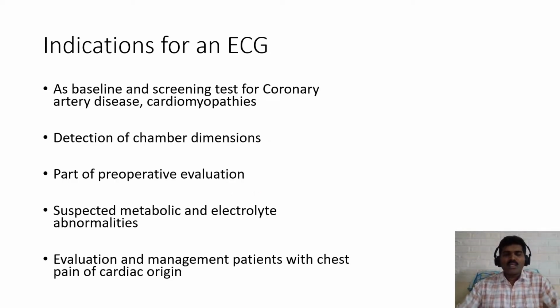So what are the indications for an ECG? Before doing any procedure, you should know indications, contraindications, and any complications of the procedure. Basically, ECG is a non-invasive procedure. There won't be any complications, except that you should remember whether the patient is allergic to latex. You will be using the gel, which can be allergic. That is the only contraindication you need to look for an ECG.